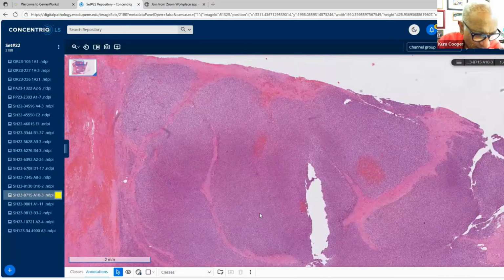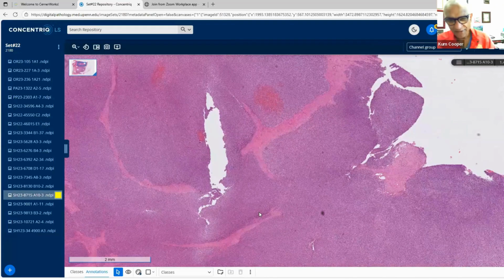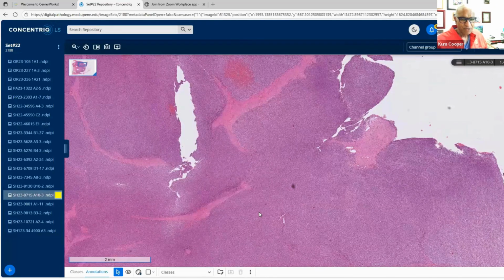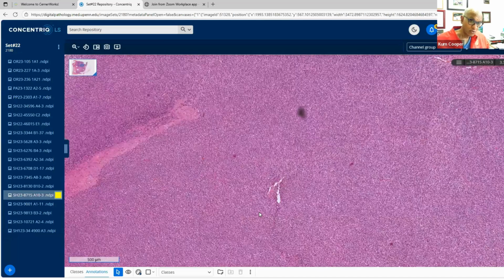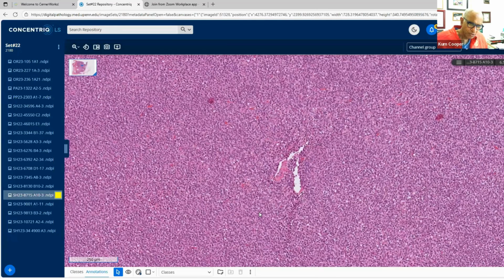That's part of my panel in looking at these. But because it's DDIF, it can lose both those markers, and you would then need to resort to STAT6 NAB2 with next gen sequencing, because those genes are so close together. You cannot use FISH. It's an inversion. I'm not a molecular pathologist and I don't know much about that, but I know that FISH won't work for STAT6 NAB2.